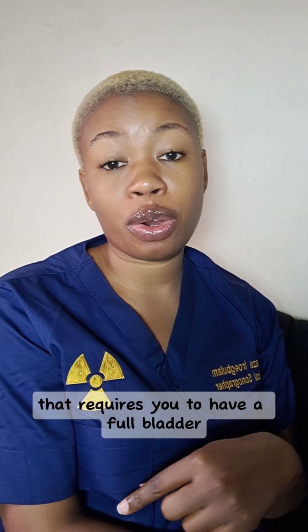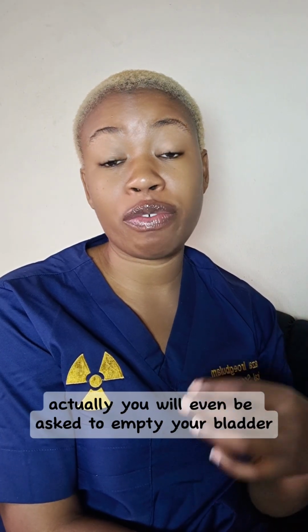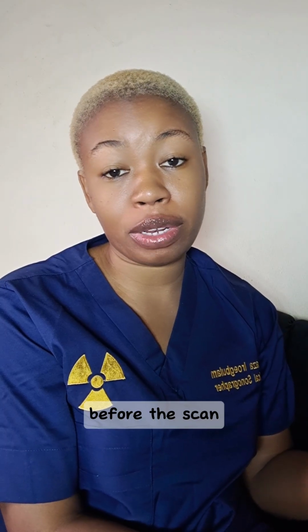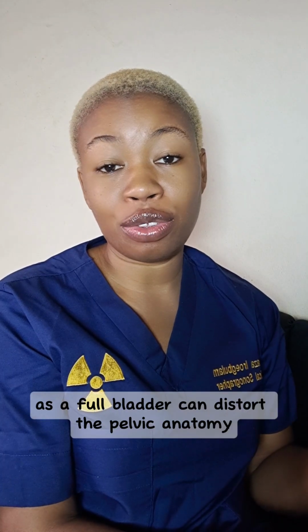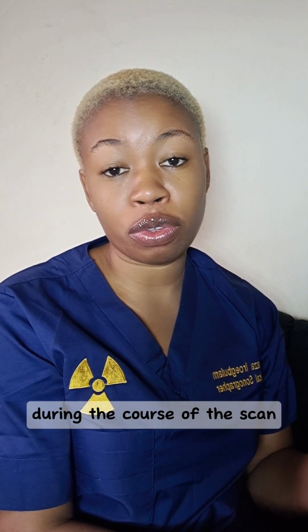Unlike a transabdominal pelvic scan that requires you to have a full bladder, for a transvaginal scan you do not need a full bladder. Actually, you will even be asked to empty your bladder before the scan, as a full bladder can distort the pelvic anatomy. It can also make the patient uncomfortable during the course of the scan.